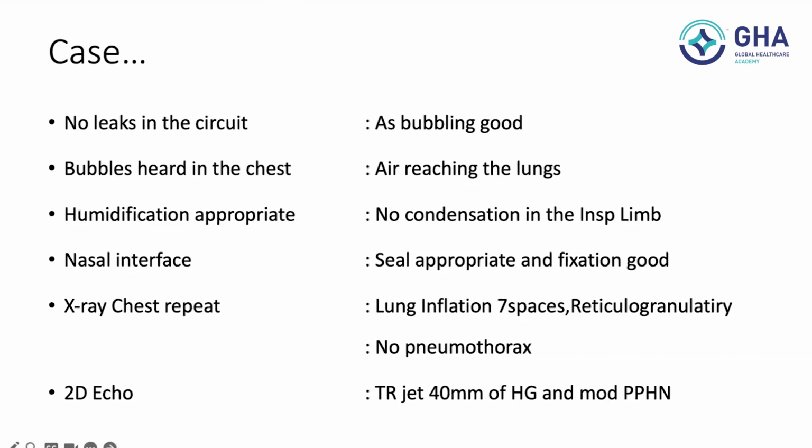We have taken care of the delivery. We have taken care of the pressure. FiO2 is reaching the lungs, but still the baby is not doing well. So what do we do now?